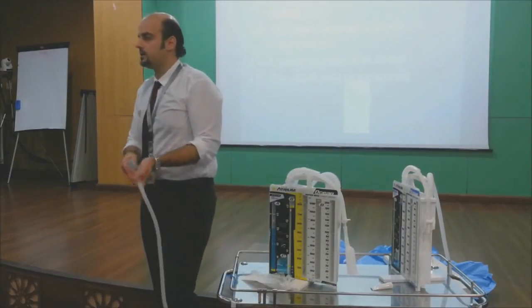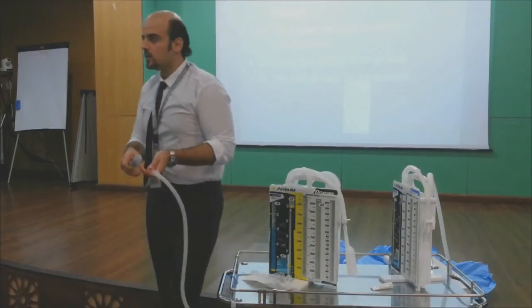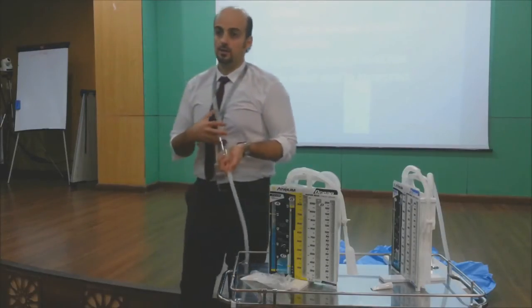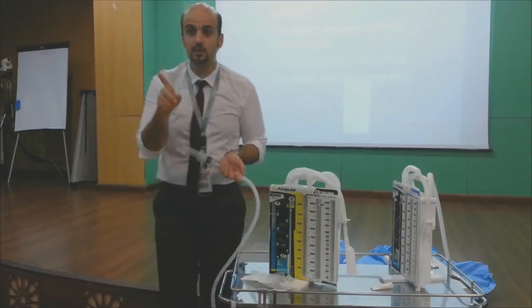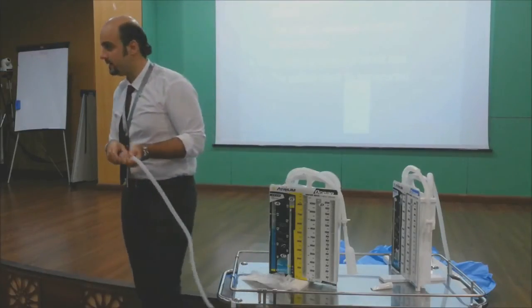So there's no tidalization. Whenever I do this or this, while something is always sucking, I cannot see the oscillation movement, okay? So while it's on suction, nobody tell me it's not working. Okay? It's working. It will work with an air leak. You can see the air leak.